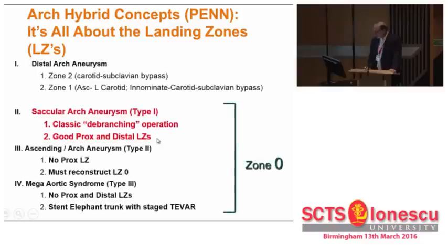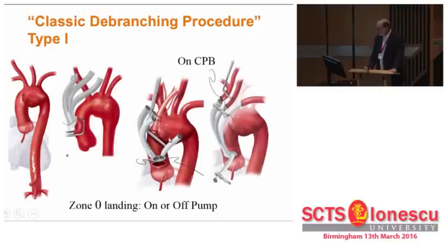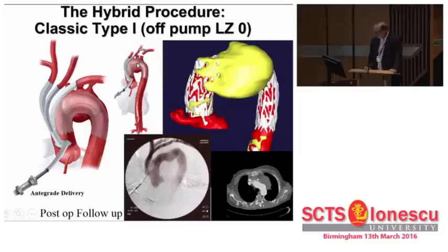So let's take a look at the type 1 operation. We can do these off bypass or on bypass. If I do them off bypass, it's very straightforward. If you do them on bypass, it's easily a 25 or 20 minute pump run. And it's just a way to make the proximal anastomosis a little bit easier and a little bit more safe, and also maybe go down to 32 degrees or so to help out with some issues regarding the brain. So the classic type 1 can be done off pump or on pump.